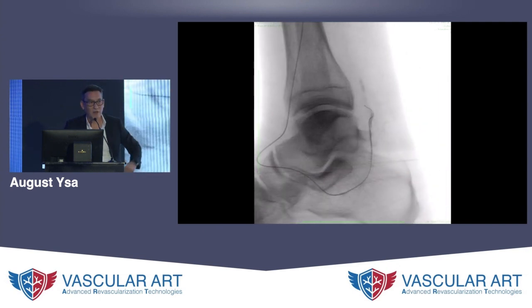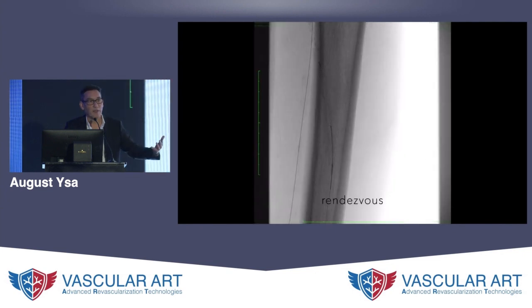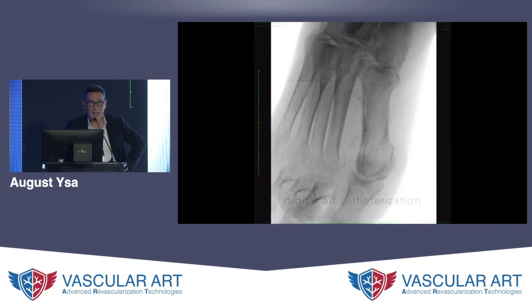the medial plantar, retrograde to the posterior tibial, and then recanalize the posterior tibial artery, perform the rendezvous within the support catheter itself, and then in an antegrade fashion it was pretty easy just to cross into the lateral plantar, and thereafter below the ankle and the forefoot we navigated the arch, getting into the first digital artery.